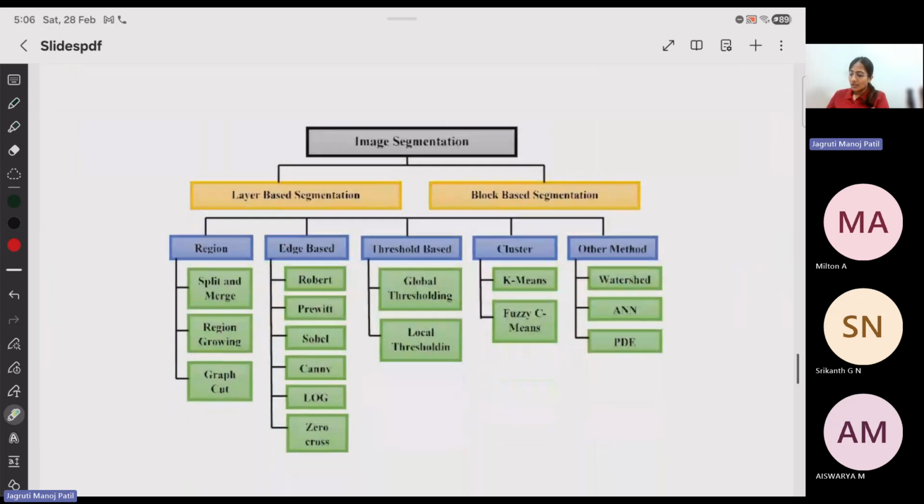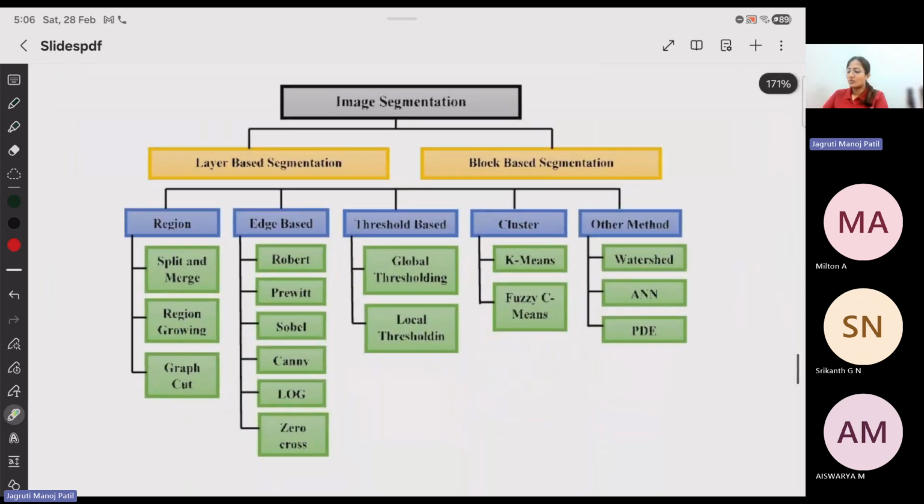This is like simple block processing for segmentation. One way is to do it layer by layer, which is how MR-based people do it. The other way is block-based segmentation, which is how ultrasound-based people do it. MR people also do block-based, but they take one entire image as one block, which increases their processing time. In ultrasound, your data is much smaller, and the data size rendered into the systems is also much less than that of MR. Of course, one is a 2D image and the other is a cross-sectional 3D image, so there are these differences.